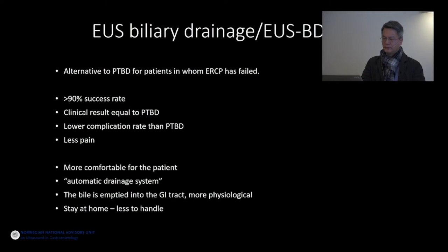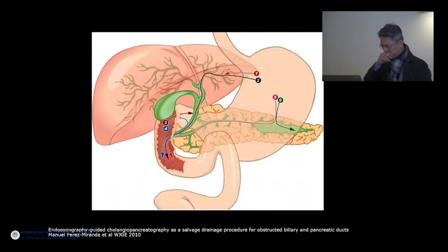In studies, the clinical success rate of EUS-guided biliary drainage is very comparable to percutaneous, but the complication rate is much lower, and it also causes less pain to the patient. It is much more comfortable for the patient because you have an internal drainage system into the bowel, and you can also use the bile physiologically. Another advantage is that the patient does not need to handle external drains and bags. And there are a few routes which we prefer to use.